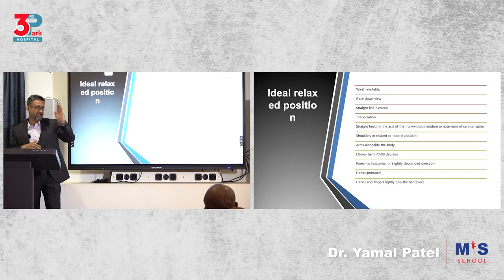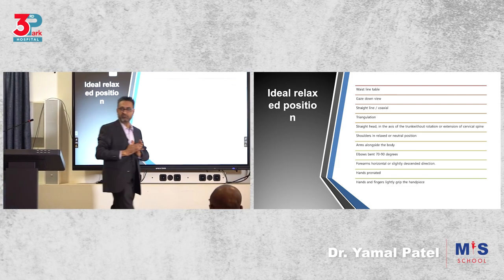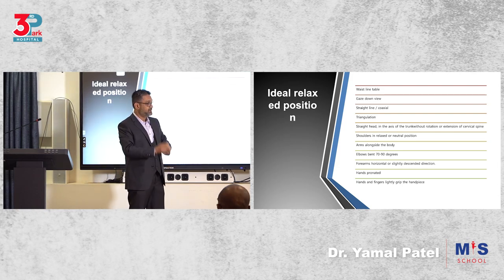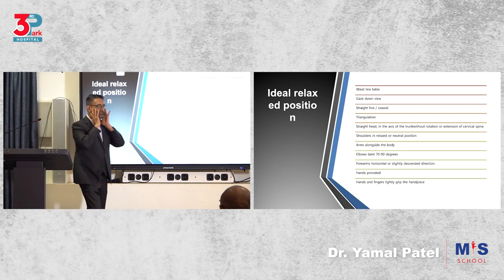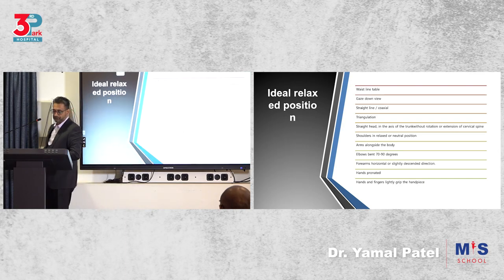Next thing, straight line. Me, pathology, view, straight line. So not me, pathology, screen. So don't operate this way. Me, pathology, view. That's how you position your scope. I mean your monitor. Triangulation, straight head. So straight head means this is how it should be. Not this way, not this way, not this way, not this way. Got it? Straight head positioning.